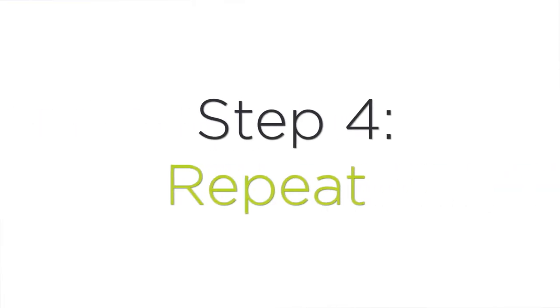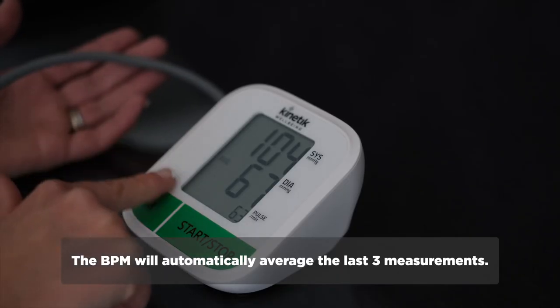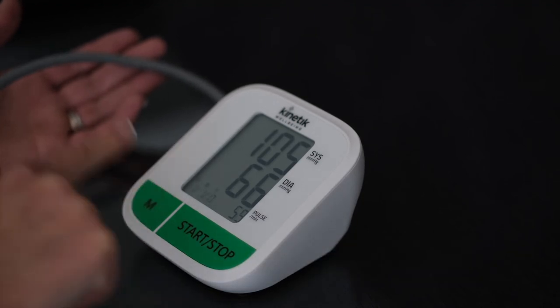Step four: repeat. Record your first reading then take two or three additional readings about three minutes apart and then work out the average.